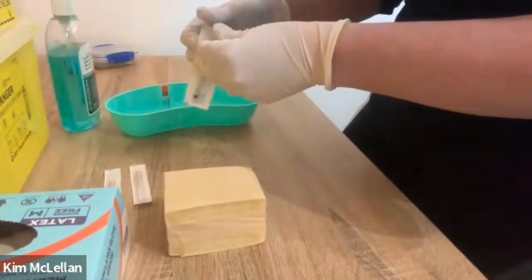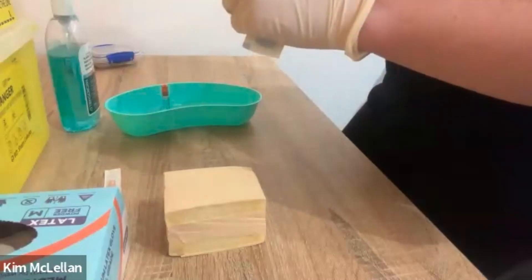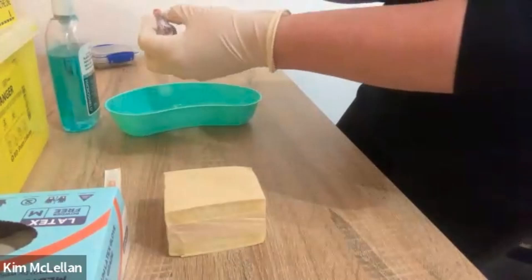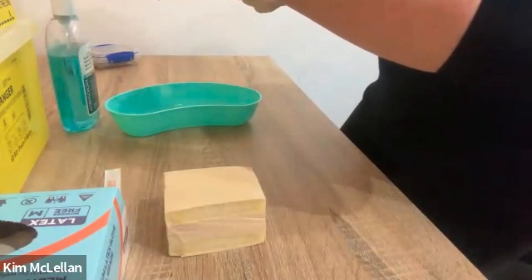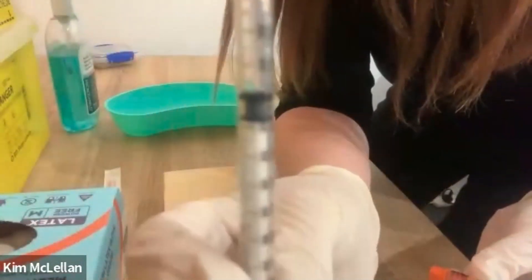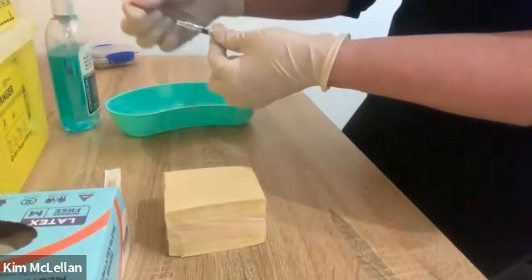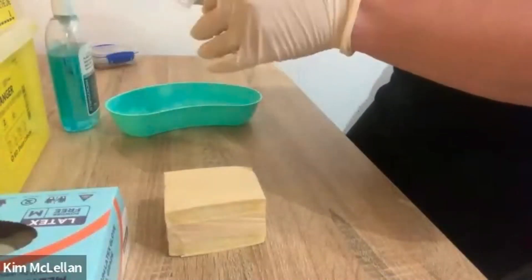Now I'm just going to open up my syringe and my drawing-up needle. Some syringes will come with a needle already on it and that's fine, you can use it. We're going to draw up 0.3 mls of insulin. We remove our drawing-up needle and pop that in the sharps bin, then we pop on our nice fresh needle which we're going to use to inject our patient with.